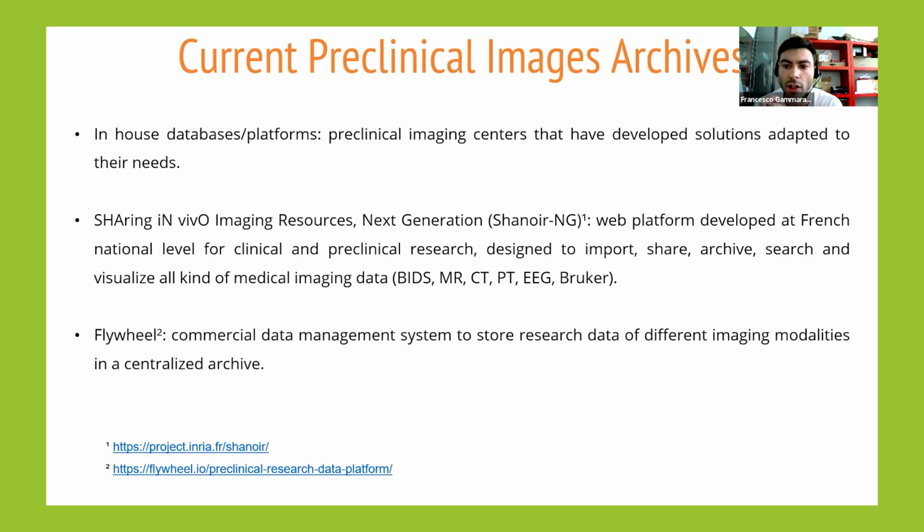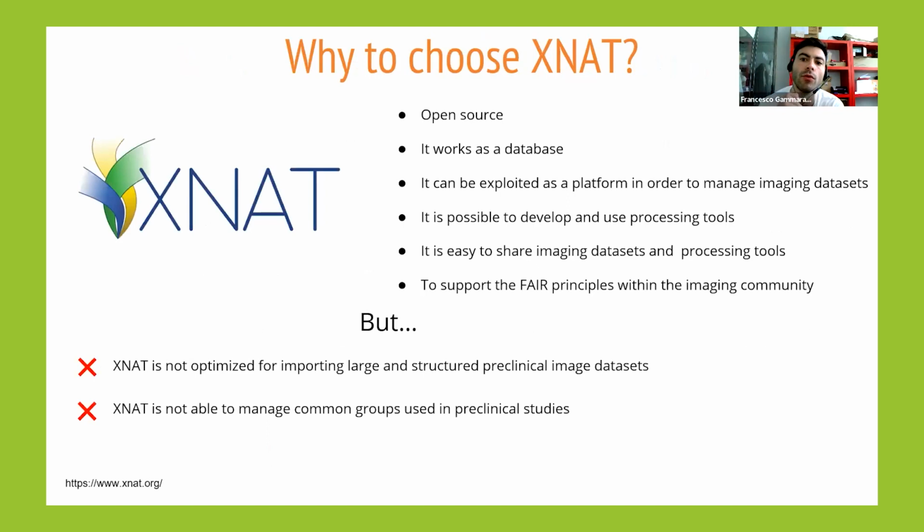And then we have Shanoir, that is a web platform developed at French national level for clinical and preclinical research, for importing, sharing, searching, and visualizing medical imaging data. And there is Flywheel, that is a commercial data management system. So we don't have a solution for our needs, so we decided to use XNAT for preclinical imaging centers.